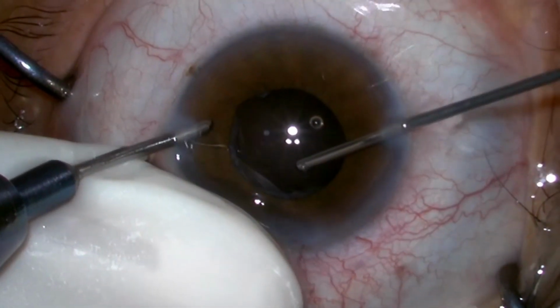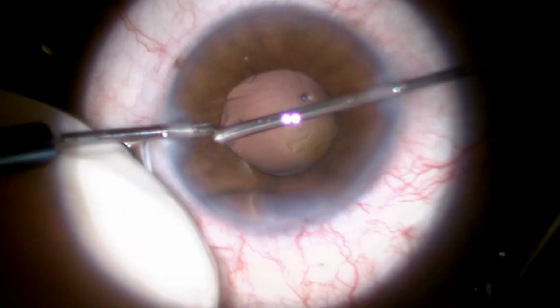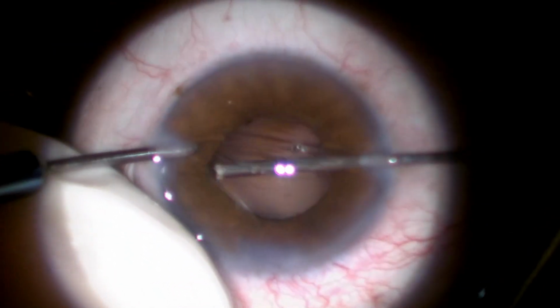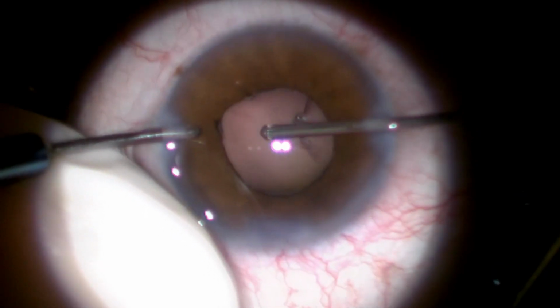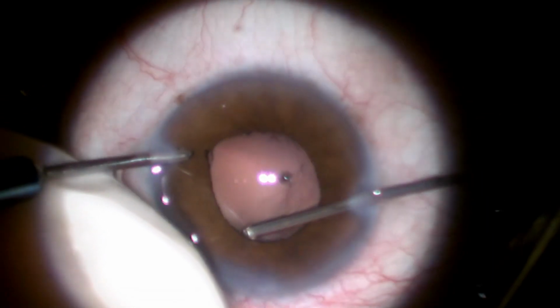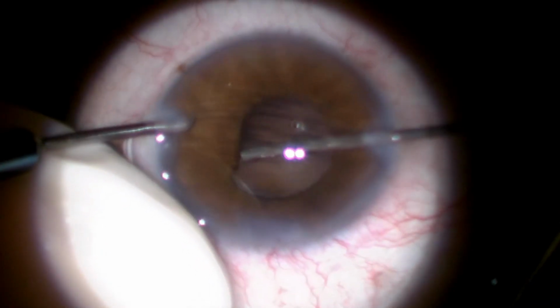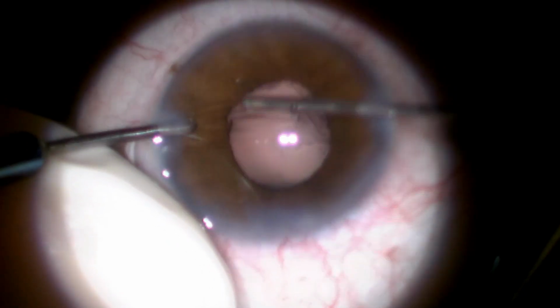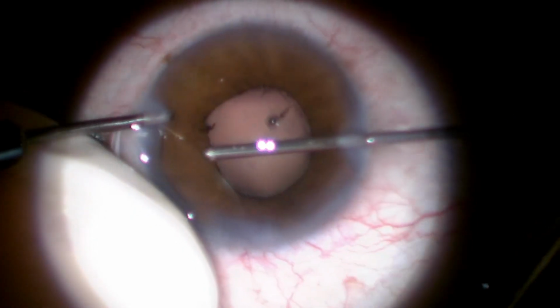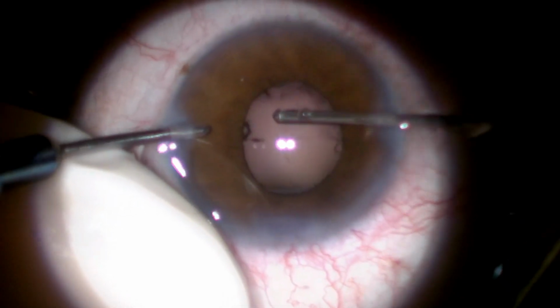We are trying to cut all the vitreous strands that are possible. When we go with the cutter under the iris, at that time we are not using the cutter. See here, the vitreous is attached, and the vitreous strand is there, and now it is free.